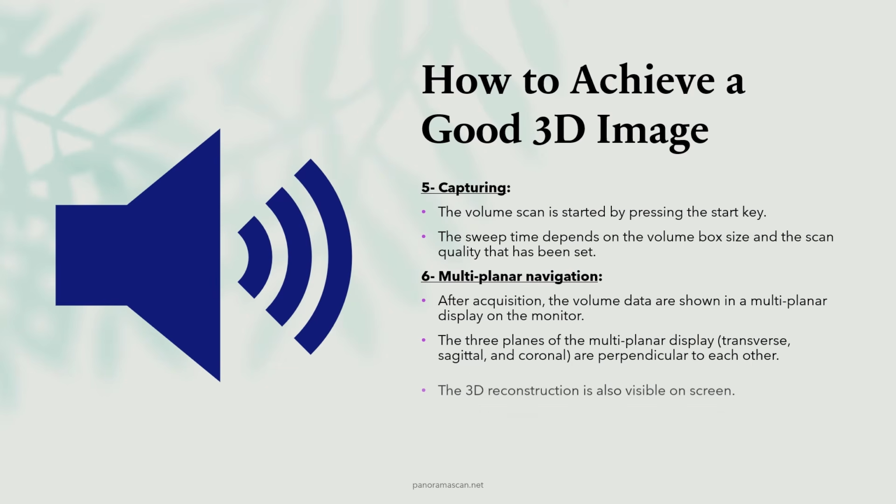In addition to these planes, the 3D reconstruction is displayed on the screen, showing a full 3D representation of the region of interest. This enables the operator to assess the structure in 3 dimensions and make further adjustments as needed.